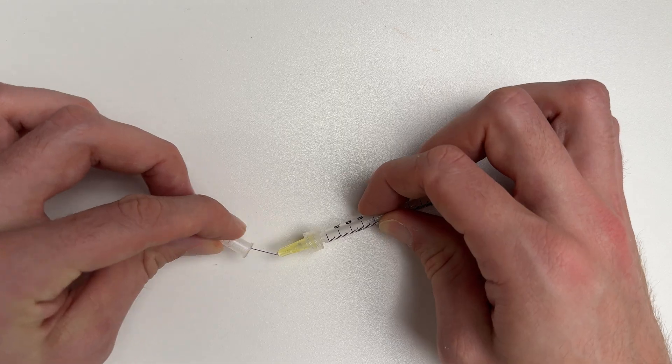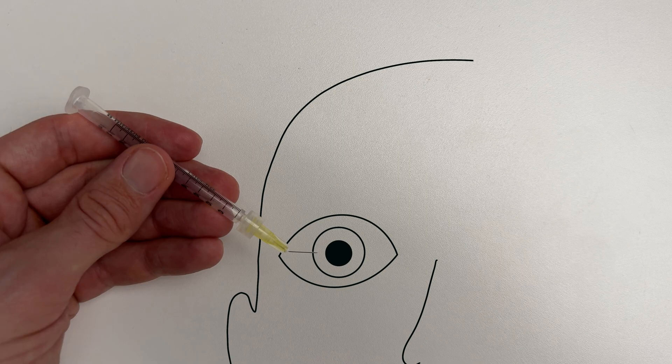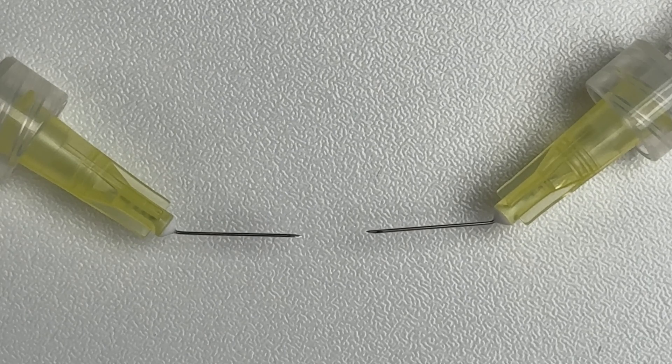I personally like bending the needle. This makes it much more ergonomic and easier to rest the hand on the patient's head. If I'm treating the patient's left eye, I'll bend and hold it this way. For the right eye, I'll bend it in the other direction. So depending on which eye you treat, you should have it bent one way or the other. Because it's hard to film a 30 gauge needle for a video, I'll show you how to do this with a 25 gauge needle.